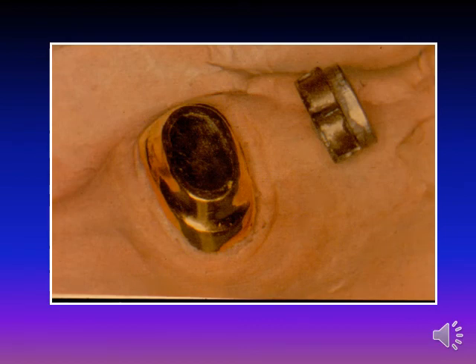This magnet: the magnet is attached to the fitting surface of the acrylic resin, and the magnetic keeper is attached to the coping cemented to the root surface or implant fixture.